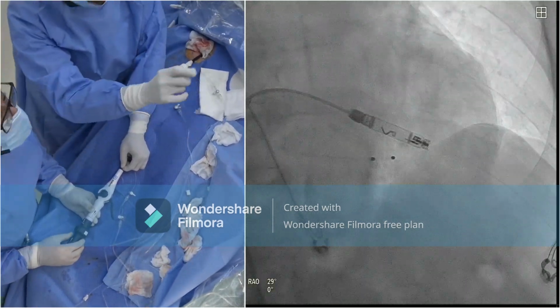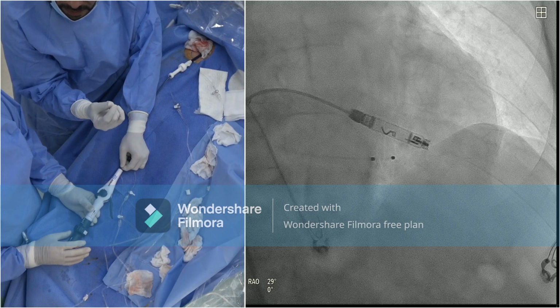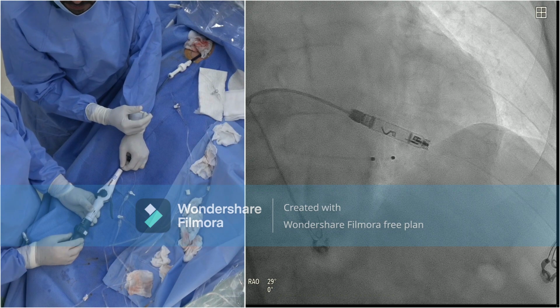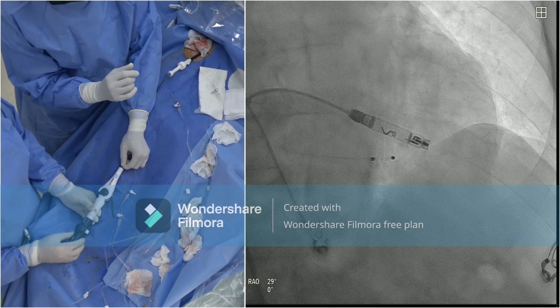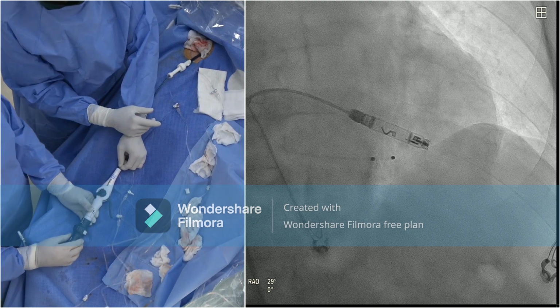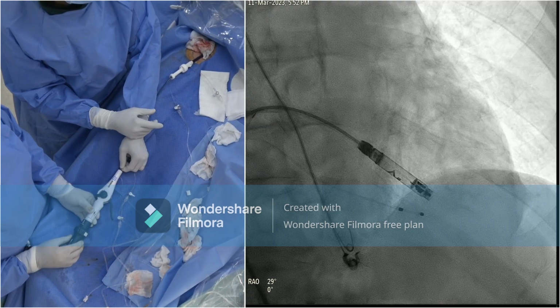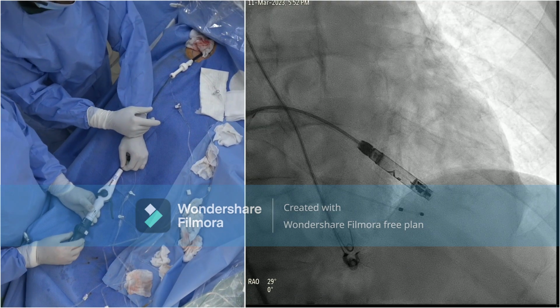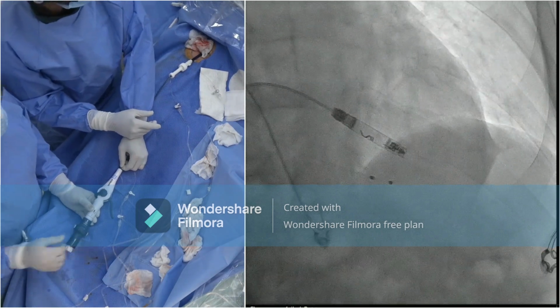We need the fixed one, the one that is fixed, not live. Okay, because this is my reference. We need to see the reference. Yeah, but I need to see it. I agree. It's very crucial. So this is 1 turn. Okay, we go live again. Still halfway to go.